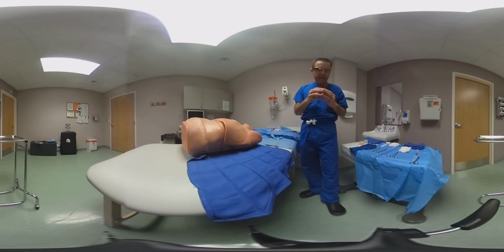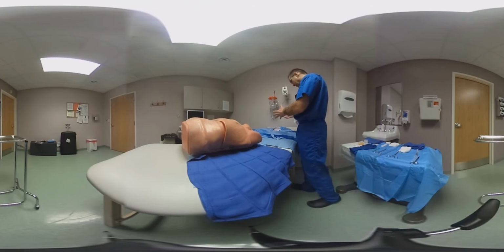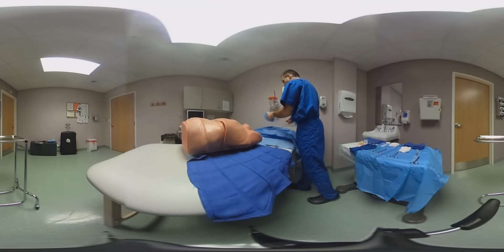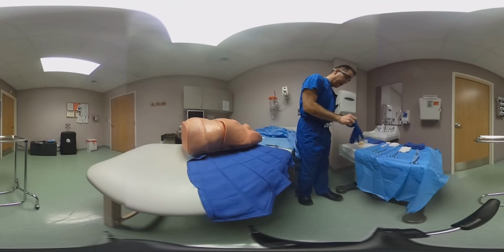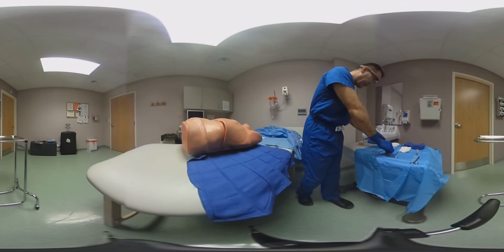So in any case, it's very important, as with any surgical procedure, that you follow your universal precautions. I'm going to obviate them for the purpose of the screening, but you put your mask on, and a hat as well, and obviously a surgical gown to protect yourself. And most importantly, the surgical gloves. So, surgical gloves on.